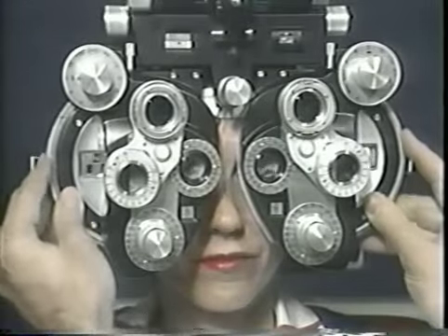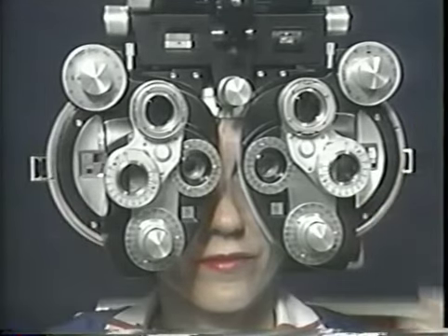A 20/40 line of letters is presented with the patient seeing 2 lines of letters, one above the other. The right eye sees the lower line. Both eyes are fogged, and the patient is asked if both lines of letters are equally blurred. If the patient reports the lower line to be clearer, more plus power is dialed in before the right eye until the lines are equally blurred. The 6-prism diopter prism is then removed. The smaller lines are shown binocularly, and sphere is changed binocularly in the minus direction until best vision is reached.